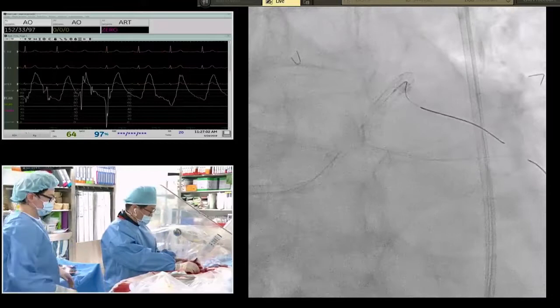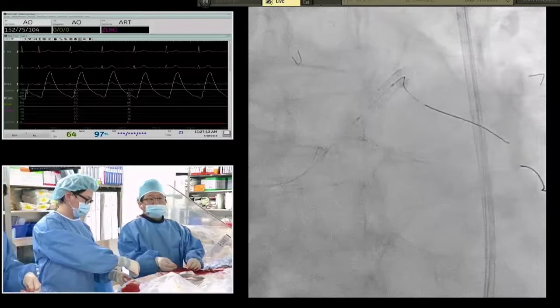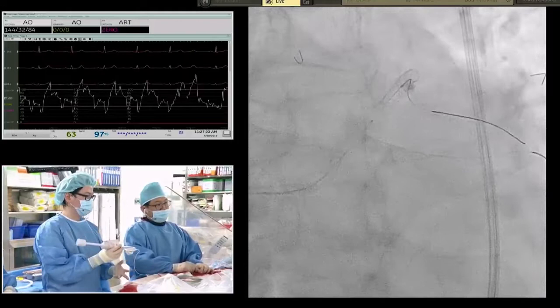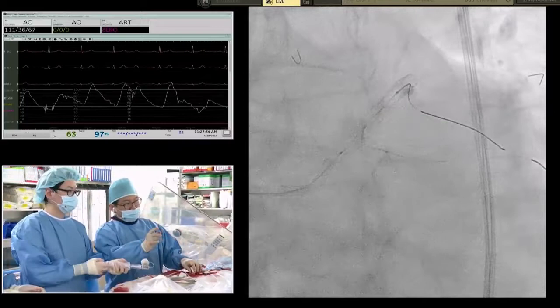Yeah, again, I think we'd all get nervous about atherectomy given the angle. It could have been done over a stiffer wire to straighten out that angle. I think in the future, this will be a nice case for shockwave to debulk and improve the compliance of these types of lesions. So one concern is the cutting balloon. The balloon is a compliant or semi-compliant balloon, so I think there is not enough power to break the calcium. So inflate.